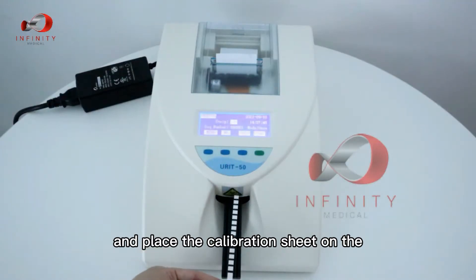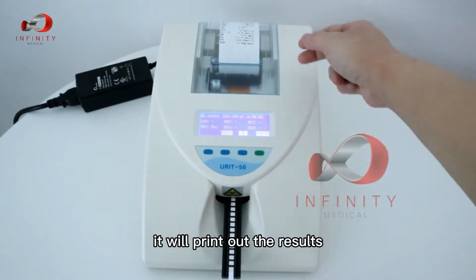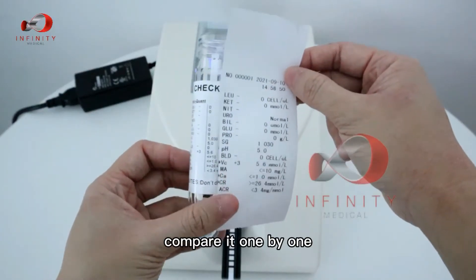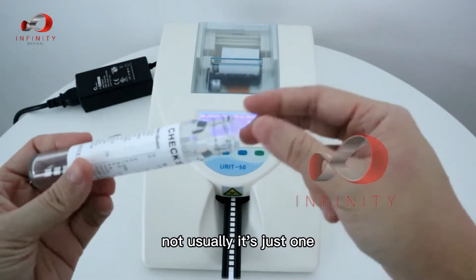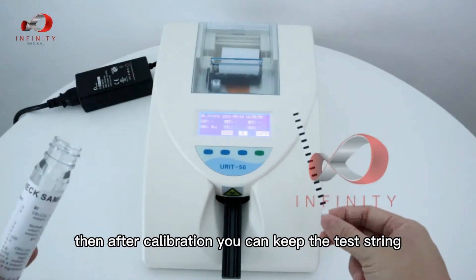Place the calibration strip on the test shelf. The calibration process runs and then prints out the results. Compare the printed results to the expected values from the test sample, checking one by one to ensure nothing is wrong. If results differ, you can repeat with the second strip, but usually one test is sufficient. After calibration, keep the first strip.